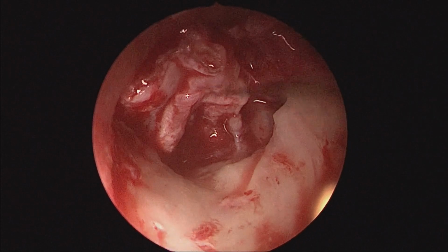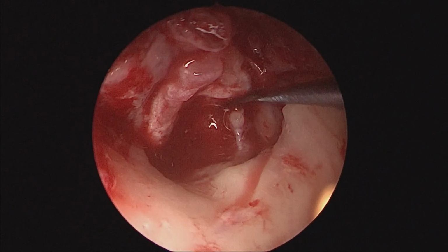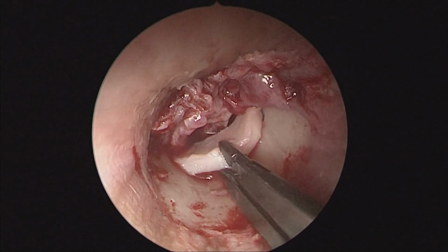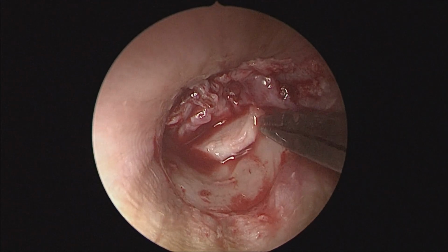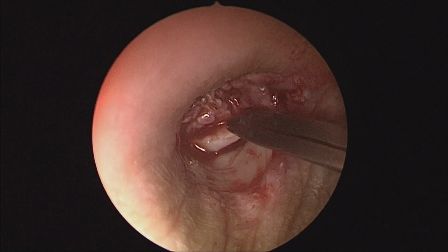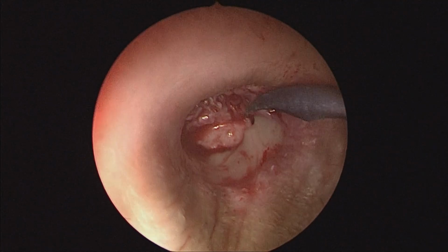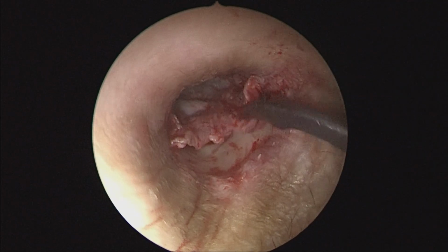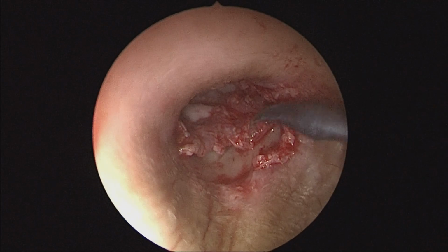Now as we lift it, we have seen that this part is done. Now all we would require is to place a full thickness cartilage shield graft over the stapes head directly as a piece of graft. And this cartilage graft has perichondrium attached on the lateral side, the side that faces the canal, and is bare medially.